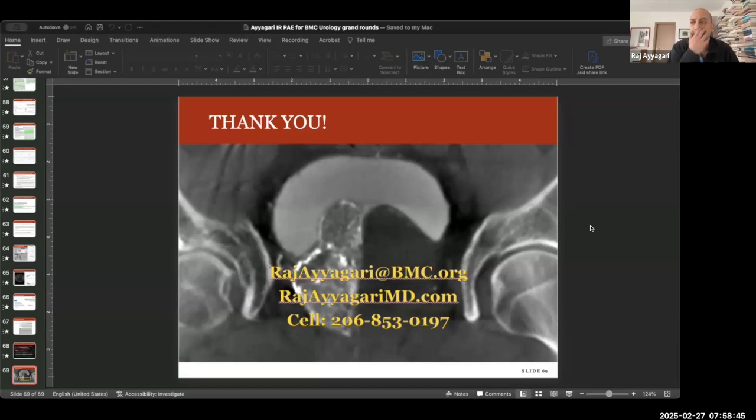And so once I got more comfortable with the procedure, I realized that getting that pre-procedure CT scan was not really changing my management at all. I was almost always going to be able to find the arteries and get into them anyway. And there are always a few patients that surprise you, and even though you can see the vessel nicely, you can't get into it. Again, having the CTA may not really change that either. But there's a lot of difference of opinion on that.